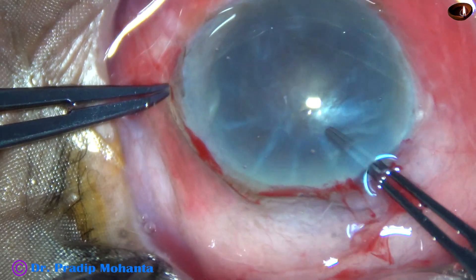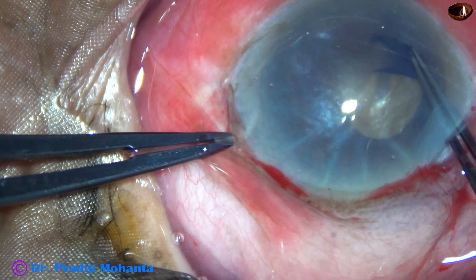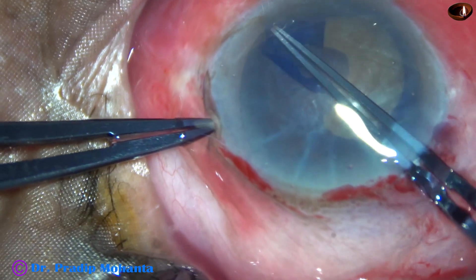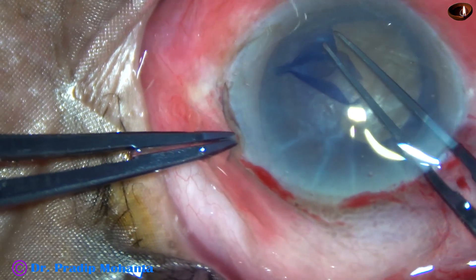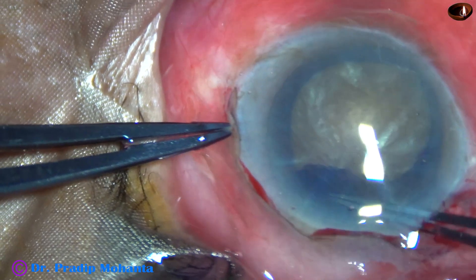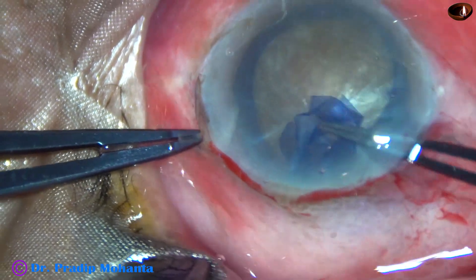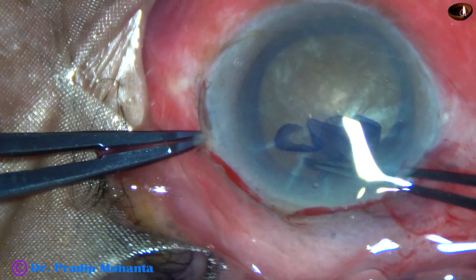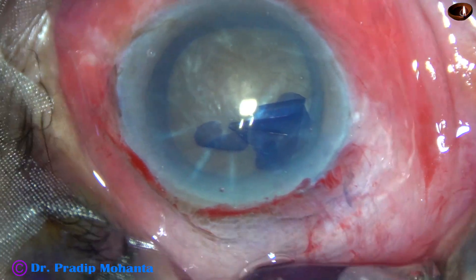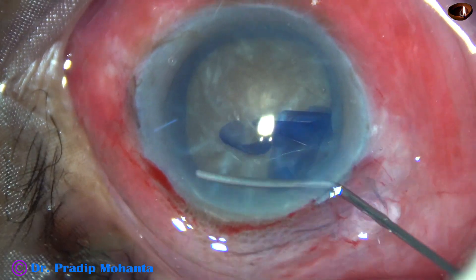Now I have taken a Utrata forceps. I hold the capsular tag, go anti-clockwise and do a large rhexis. In hard cataracts, nucleus management becomes safe and possible if the rhexis is large, about 6 mm — should not be less than 5.5 mm. And now the rhexis is almost complete. It is not a perfectly round rhexis, but this is a large rhexis and the surgery will be very safe because of this.